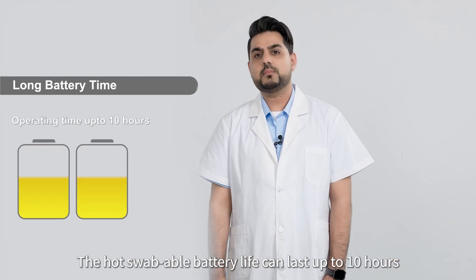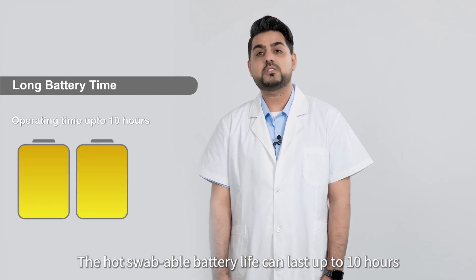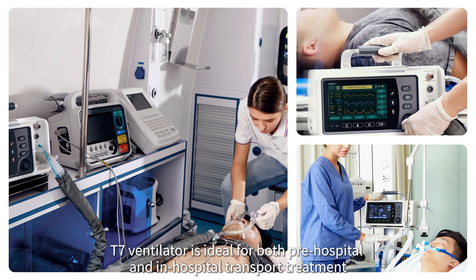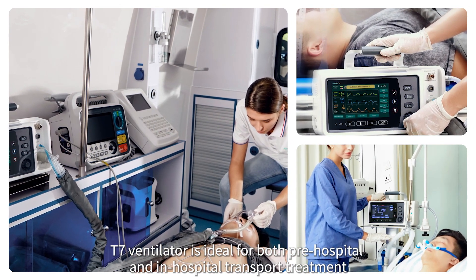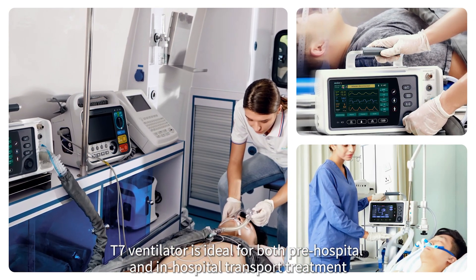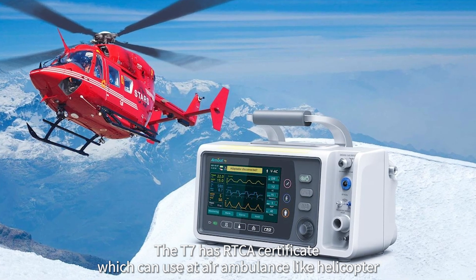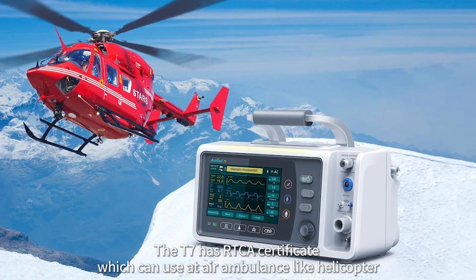The hot swappable battery life can last up to 10 hours, and it supports charging while operating. The T7 ventilator is ideal for both pre-hospital and in-hospital transport treatment. The T7 has an RTCA certificate, which allows it to be used in air ambulances such as helicopters.